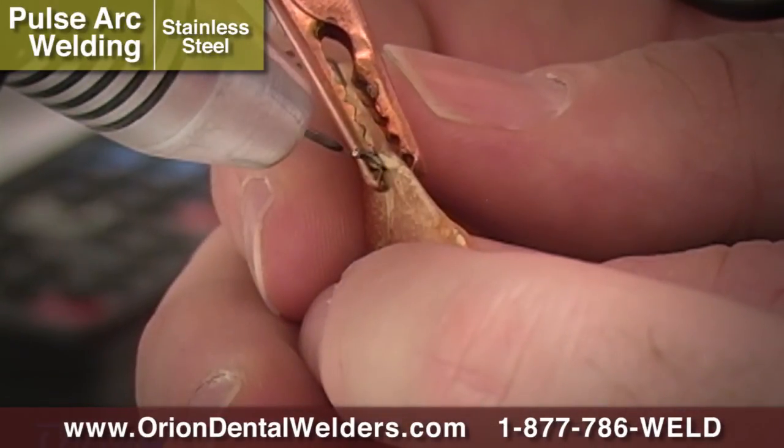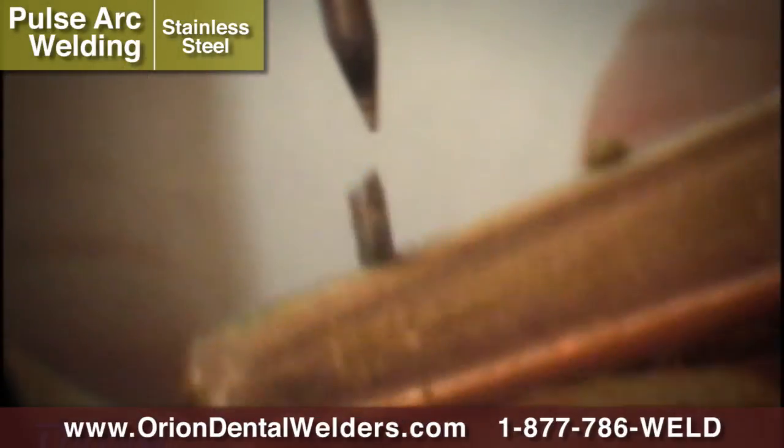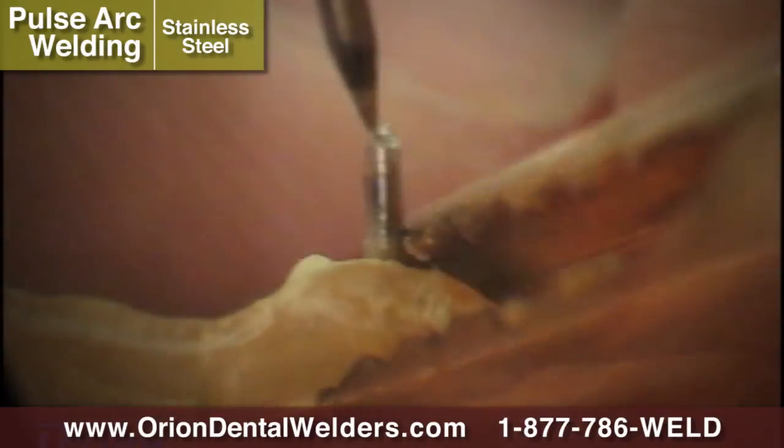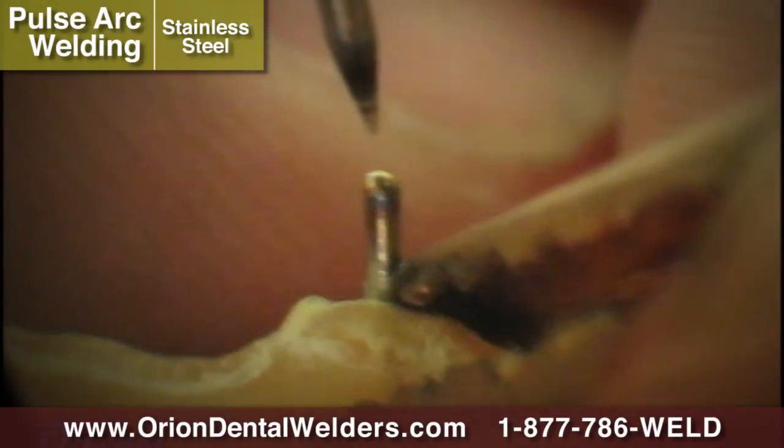Many times in retainer fabrication, sharp wire points are left exposed. These sharp points can be uncomfortable for the patient. The Orion can be used to quickly smooth any sharp wire ends.